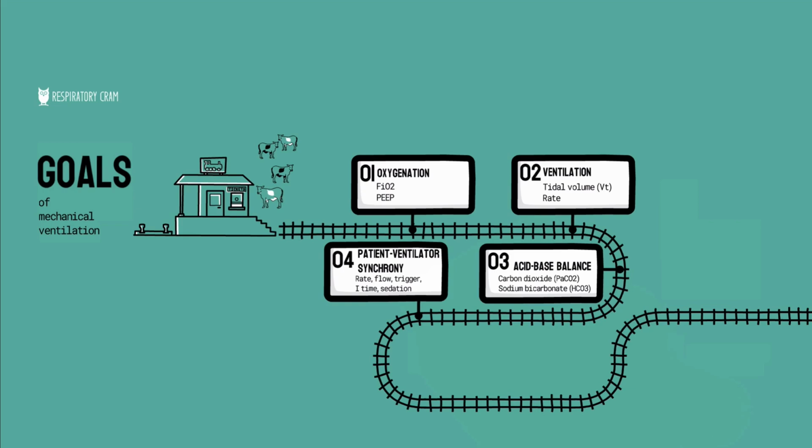So which ventilator settings can cause patient ventilator asynchrony? Insufficient exhalation time is one. Let's say your patient doesn't have enough time to exhale. That's going to make them very uncomfortable. They're going to stack their breaths one on top of the other, and that can actually damage the patient's lungs and cause a significant amount of anxiety for them. If the flow setting is too low or too high, same thing.